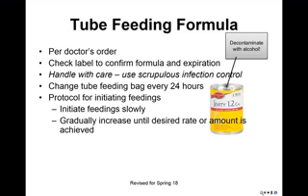Tube feeding formulas and equipment can become easily contaminated, which can expose an already compromised patient to disease-causing microorganisms. Studies evaluating the source of tube feed contamination often come back to the handling of the formula and supplies by the nurse. What's more, contaminated enteral systems contribute to the diarrhea associated with tube feeding administration.